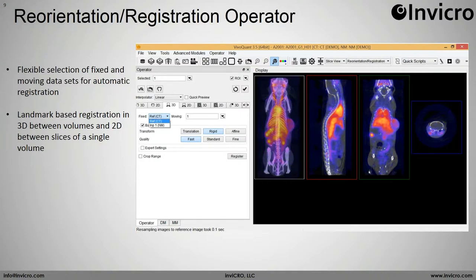We've also added landmark-based registration. Leveraging our distance and annotation tool, you can now place landmark points within the image and use those to drive semi-manual co-registration, both in 2D and 3D. This was really driven by the tissue work we've been doing here at Invicro, in particular with our cryofluorescence tomography work as well as our autoradiography work.